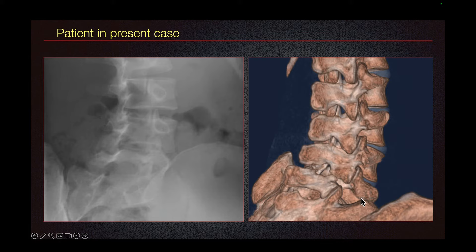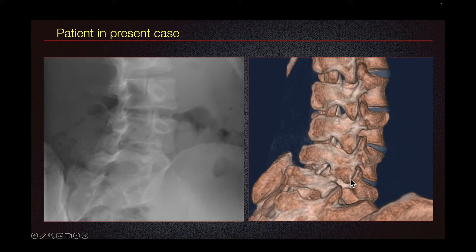Let's look at the level of the fracture. The nose of the dog is the transverse process, and the superior articular process is the ear of the dog. We don't see the neck — there's a big defect in the neck. So this is our pars fracture.